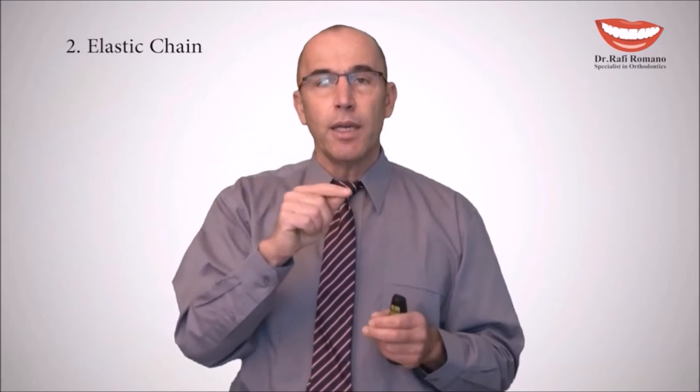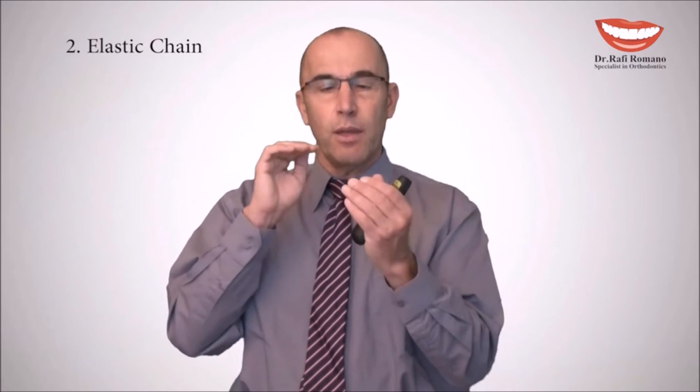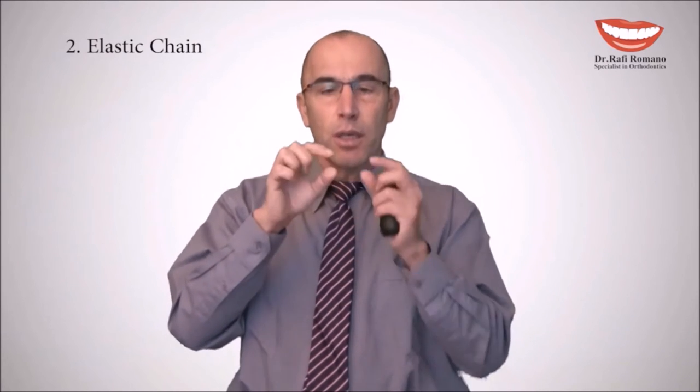The elastic chain is a different procedure where we want to apply an active force between teeth to consolidate them together, to close spaces. While applying this chain, we have to make sure that the wire is properly secured in the slot and not floating.